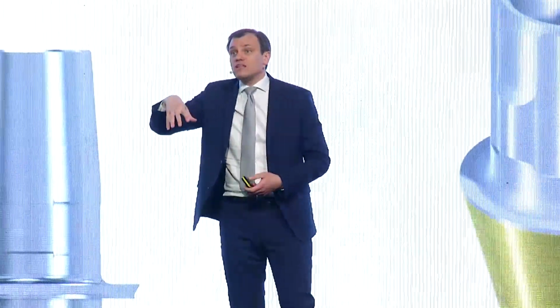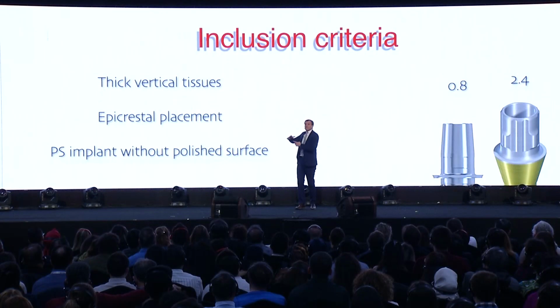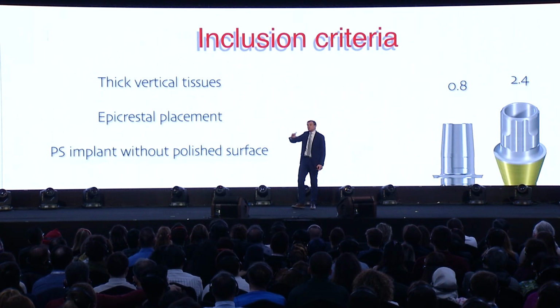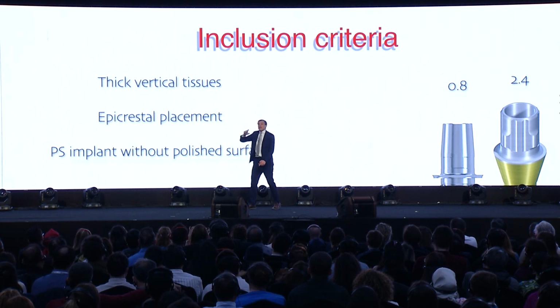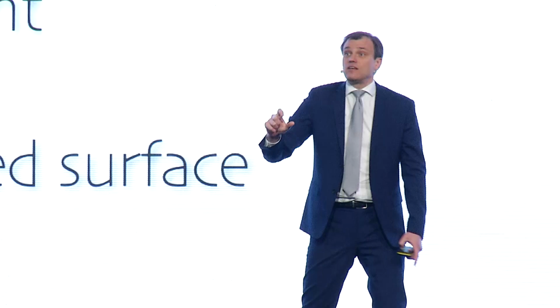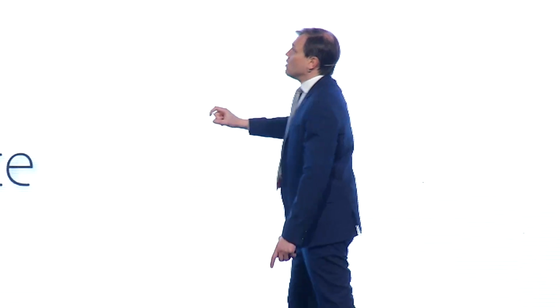It means that if the height is important, it will clearly show, because it's not just 1 millimeter and 1.5 millimeter, too small a difference. Here we had a very big difference between tie base heights, and if I'm using those in identical clinical situations, then I can really test, is tie base height important or not? That's why we created these inclusion criteria.